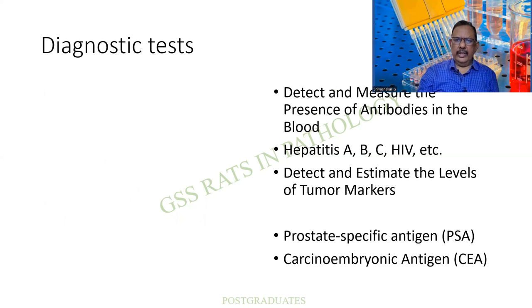What are the diagnostic tests? To detect and measure the presence of antibodies, for example hepatitis, HIV, and to detect the various levels of tumor markers, such as prostate-specific antigen and carcinoembryonic antigen.